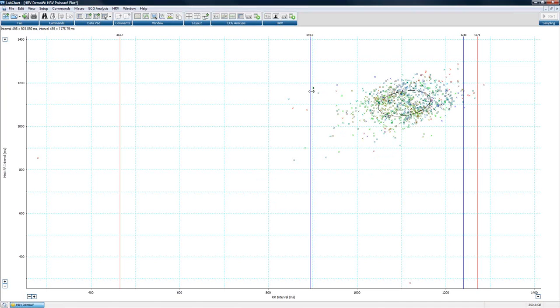So we had a green one here. Actually right here we have a blue one that occurred very, very late in the recording that's actually ectopic. And we have a few very early on that are ectopics. Great ways to see, do we tend to become ectopic later on in the file, or in the beginning, or in the middle? Just another analysis feature. And of course you can go here, right click and turn those off and they become all red.